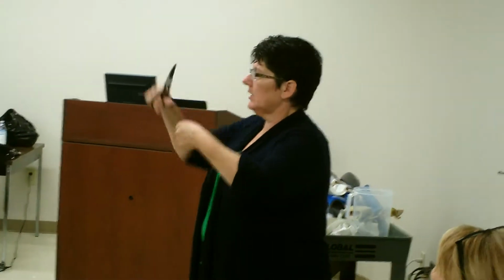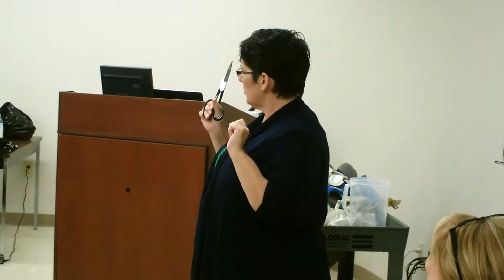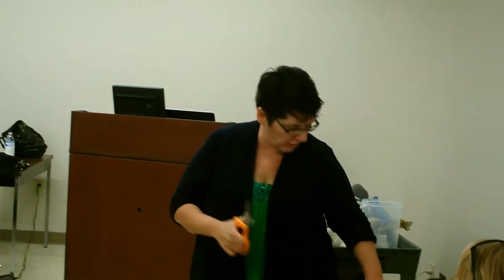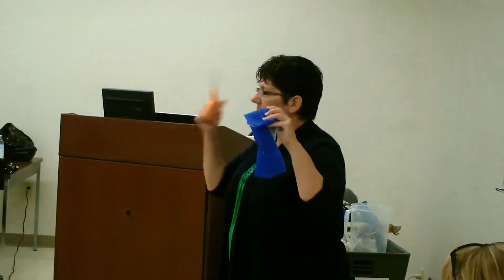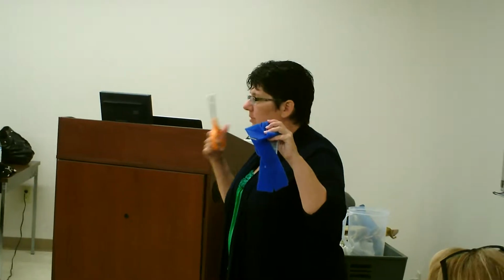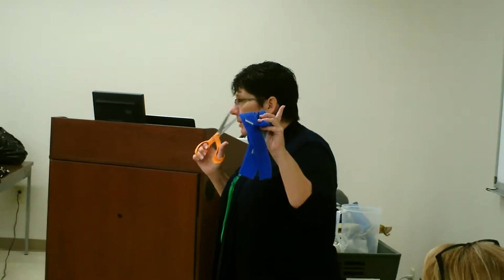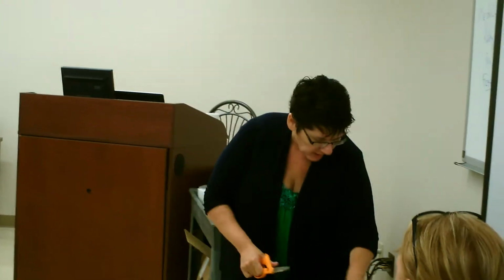Now, these are called curvy scissors. So when we make the splint, we're going to be cutting around curves. So that's what this enables you to do. So if you have a splint that has lots of curves, okay, you need that. Okay, this is used to cut splint straps, Velcro. Do not cut splint material with this because these are cheap, crappy scissors. Okay, only stuff. So if I yell at you, that's one thing I'm going to yell at you about. Okay, but it's not that I don't love you. All right. Now, this is our splint material.